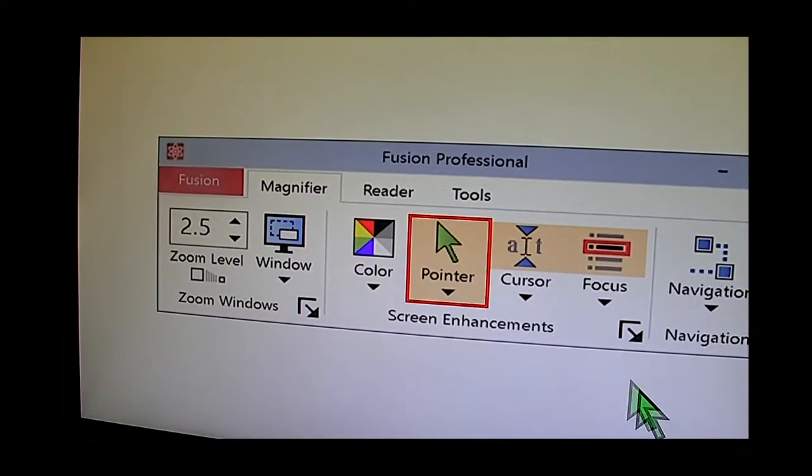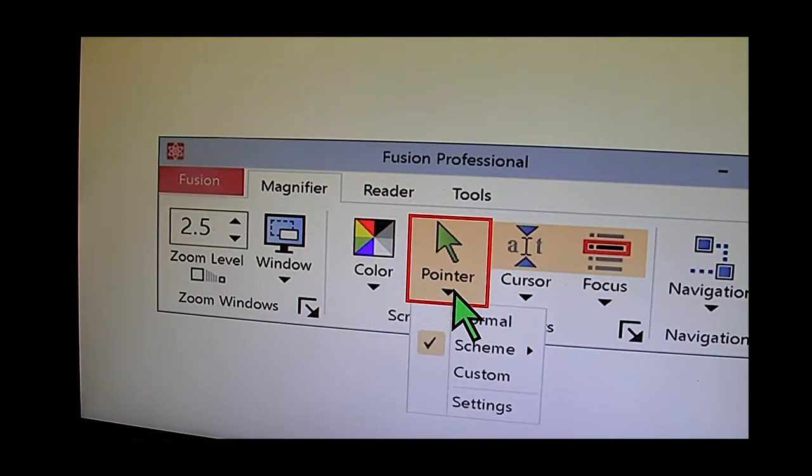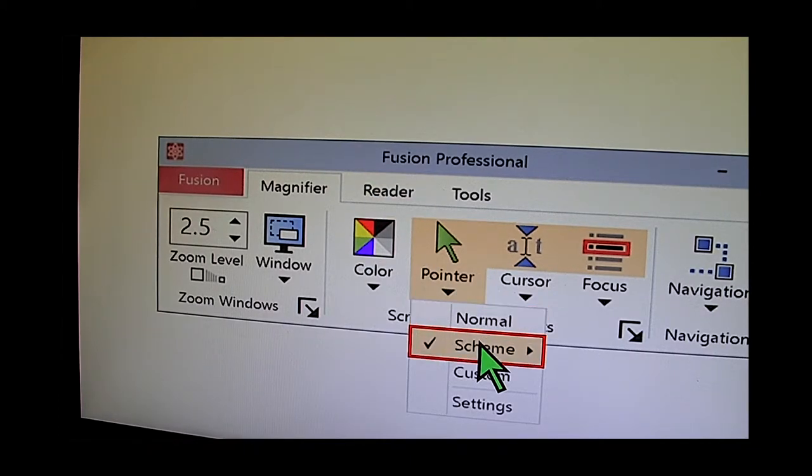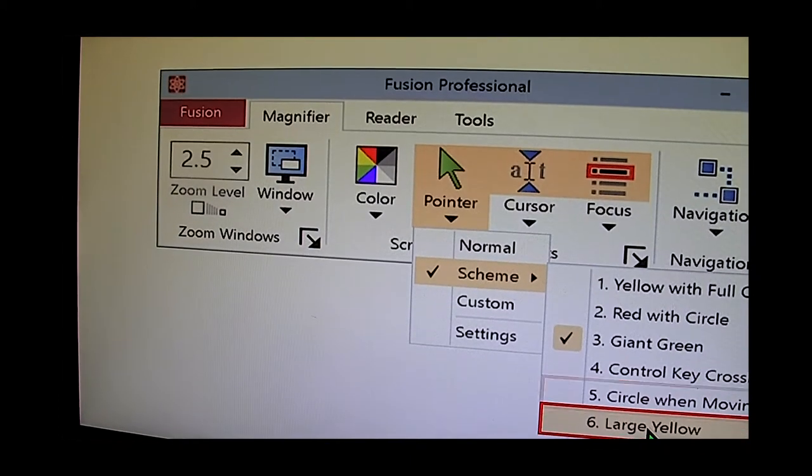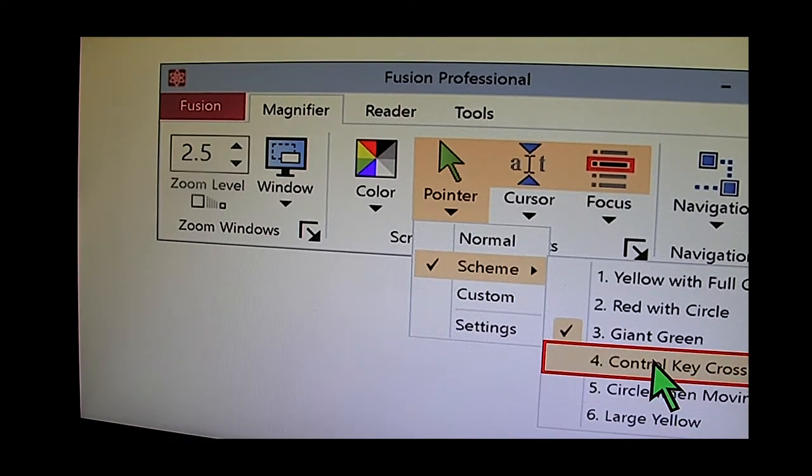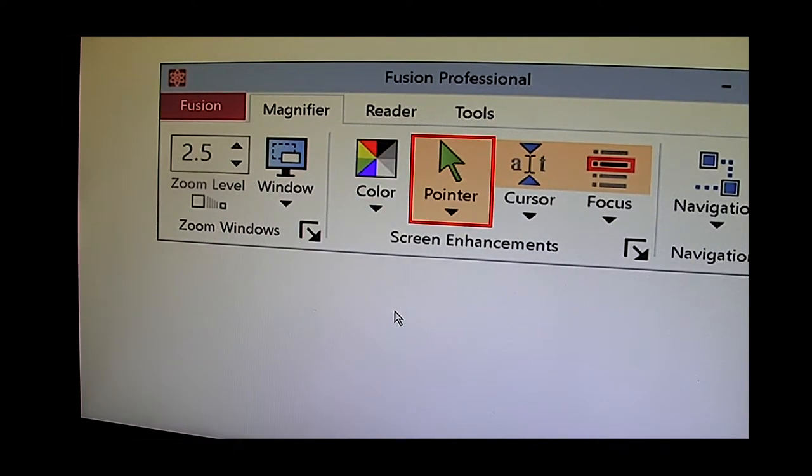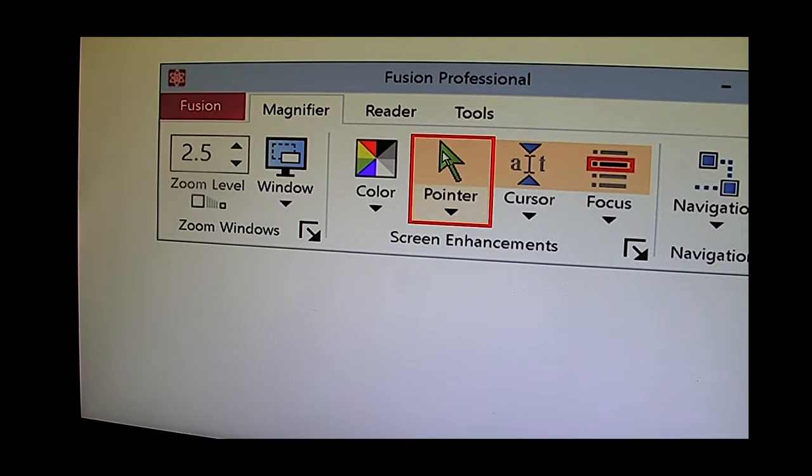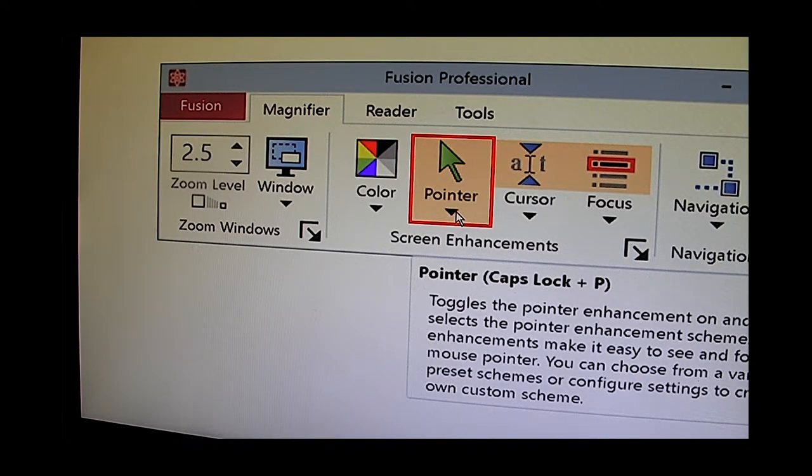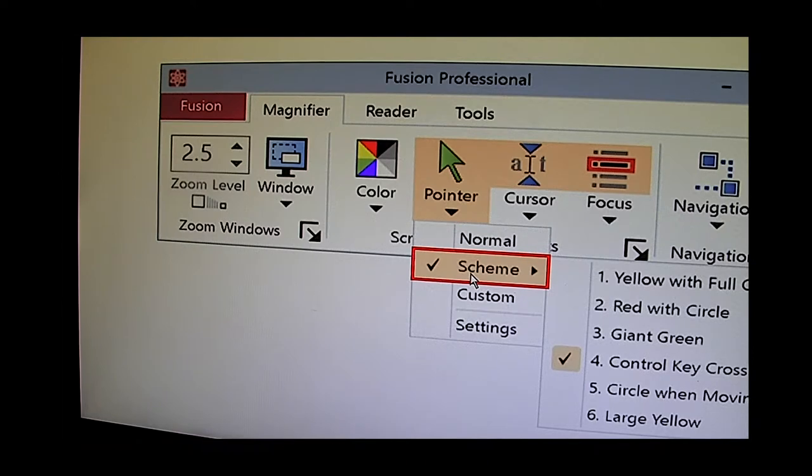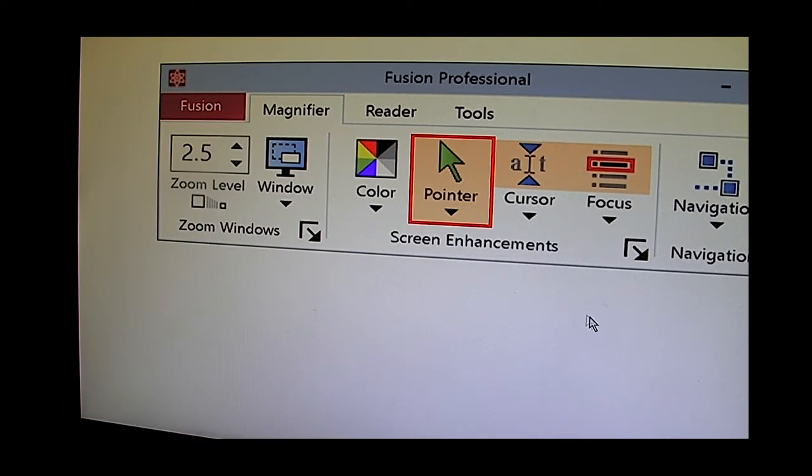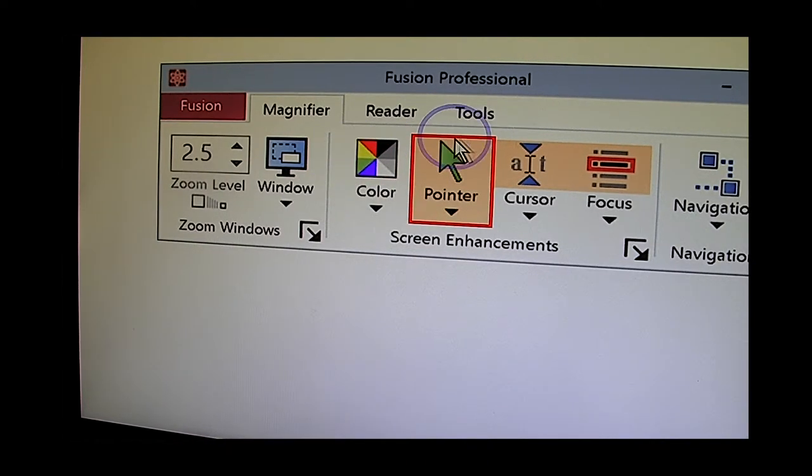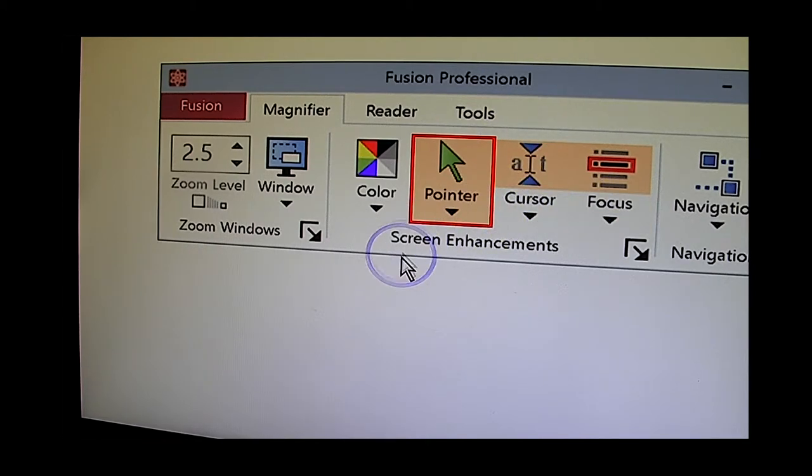For example I could have a giant green cursor. I can have some crosshairs around the pointer and I can adjust these schemes as well.